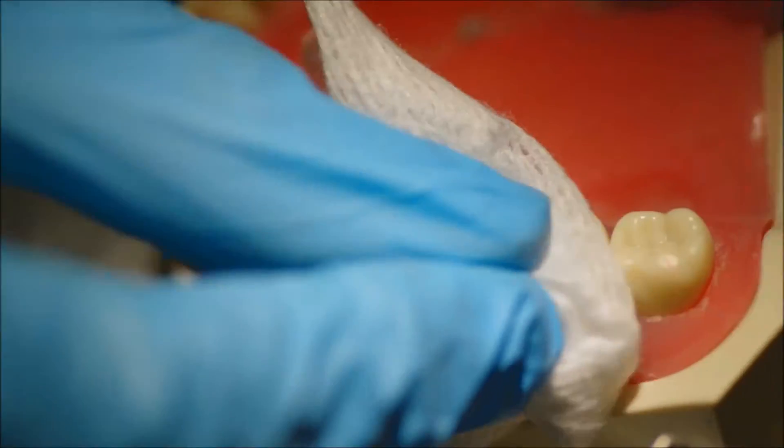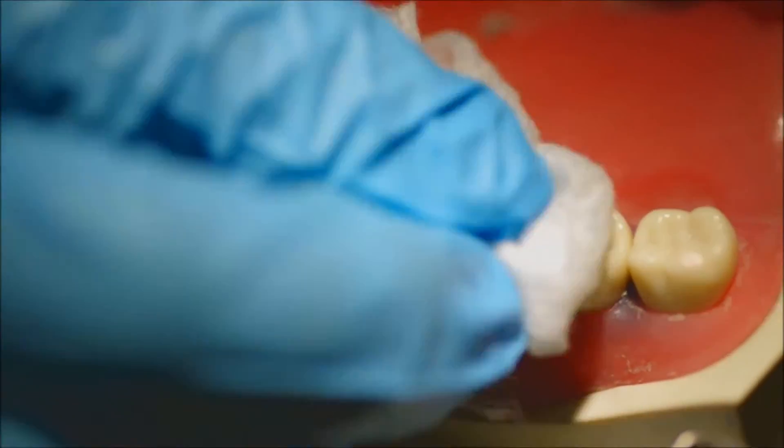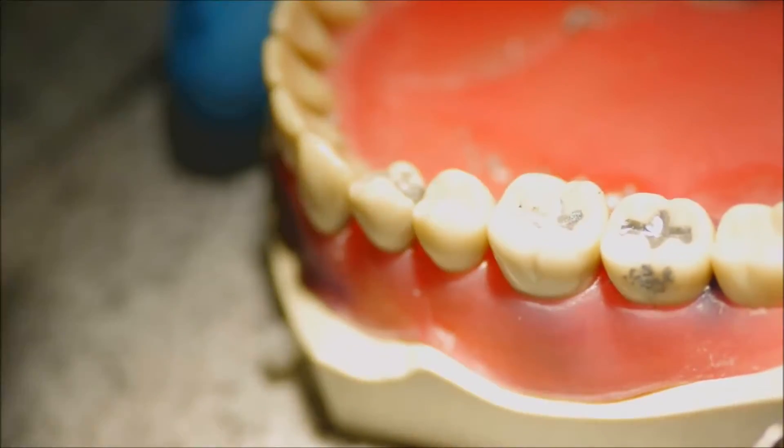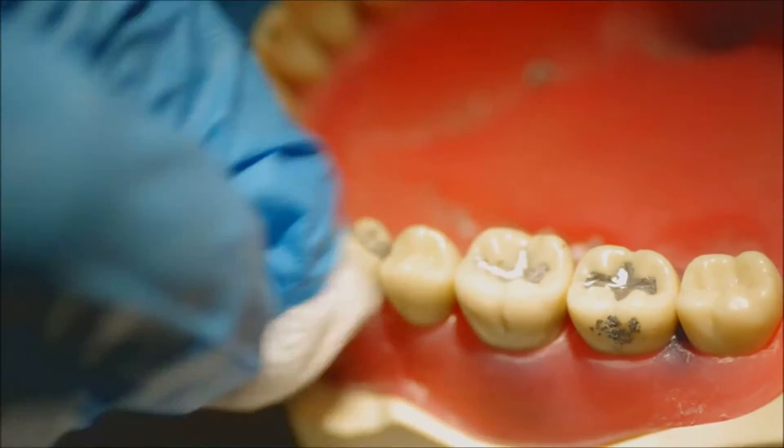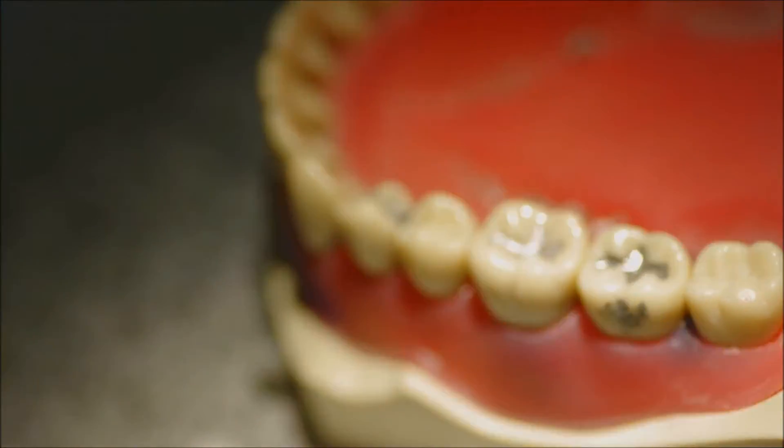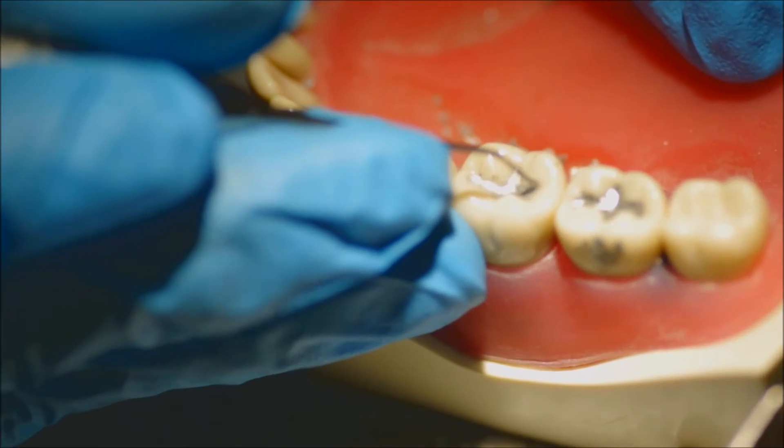Again, anytime you see flash, the easiest way to get rid of it would be to use cotton or to use a cleoid discoid carver which I will show later on in this video. I generally prefer cotton because it's honestly much simpler to use.